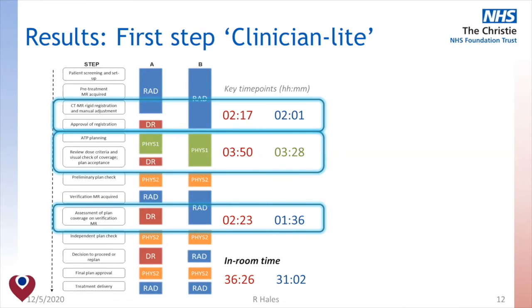And this has continued to decrease through treatment delivery. A degree of this reduction can obviously be attributed to everyone involved being more familiar now with the software and the treatment process, but hopefully it demonstrates that we've implemented a more streamlined treatment workflow and a better use of resources.